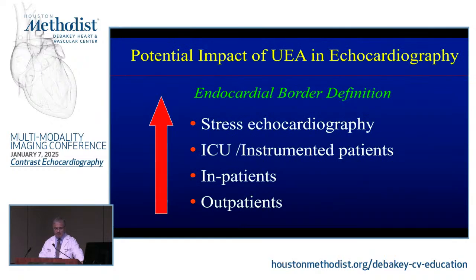Okay. How about this: the potential impact of contrast echo. Outpatient, and I have not changed this from the first year I gave this lecture, more than 30 years ago. Outpatient, inpatient, ICU, instrumentation, and stress echo. And these are probably similar in the impact of them. That has not changed.